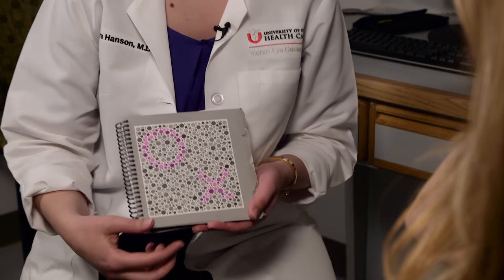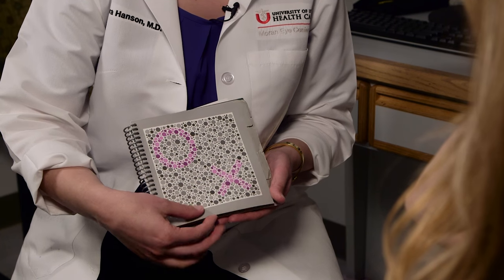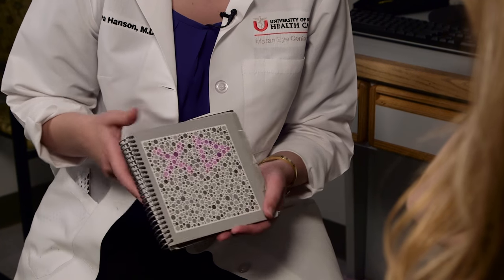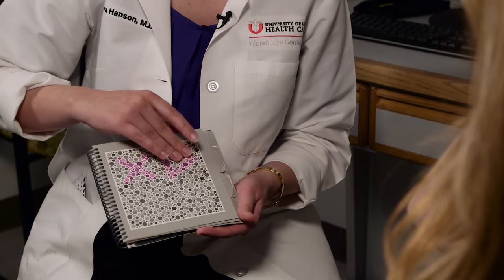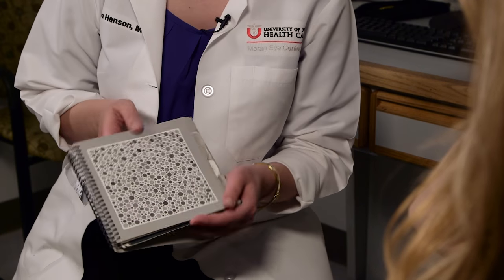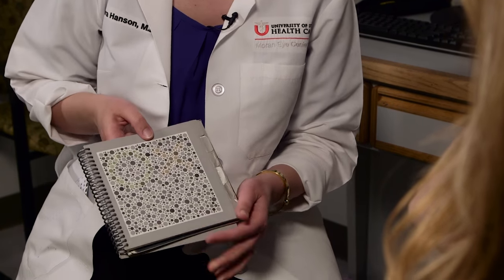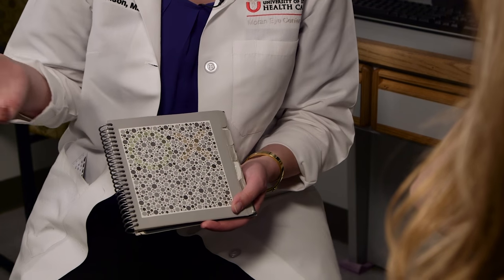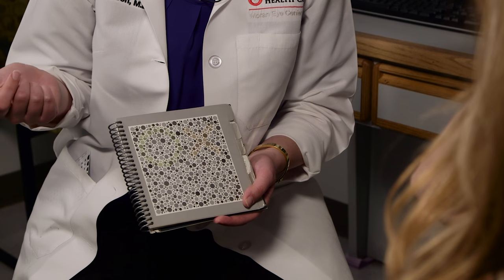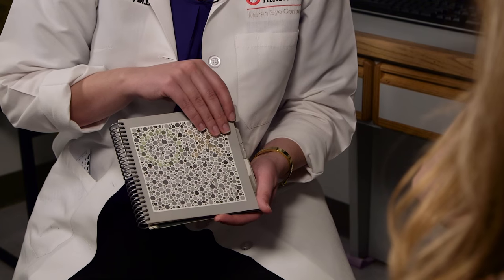We'll test your left eye first. You ask the patient to describe what they see on the test plate. You go through all four of these. The fourth is a blank plate, and then the next six plates are the screening test. Again, you have the patient test one eye at a time and ask them to go through each of the plates.